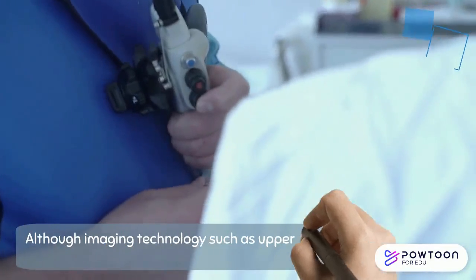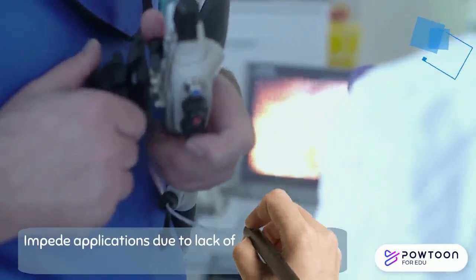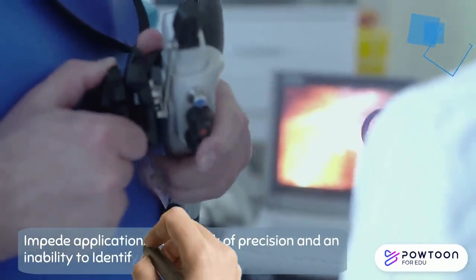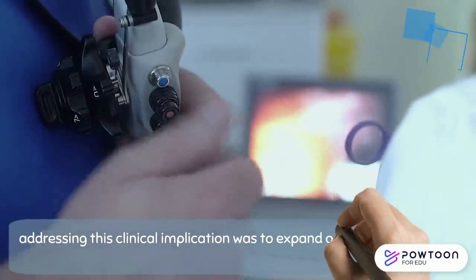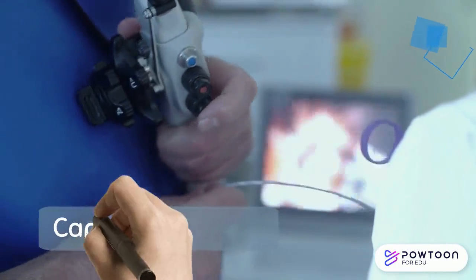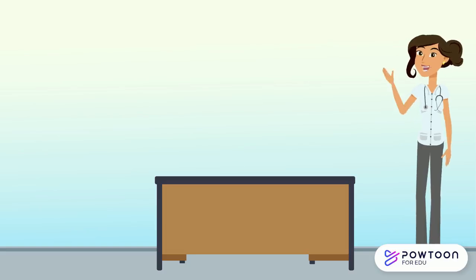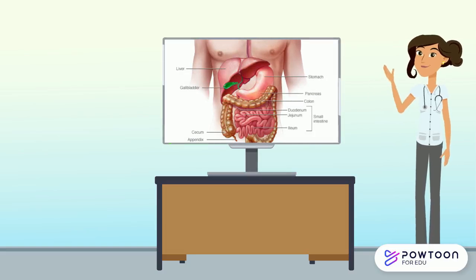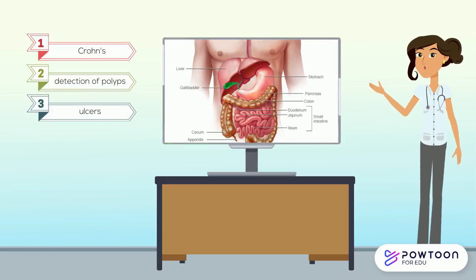Although imaging technologies such as upper gastrointestinal series exist, they impede applications due to lack of precision and an inability to identify subtle abnormalities. A means of addressing this clinical implication was to expand on the diagnostic capabilities of the small intestine with the introduction of capsule endoscopy. Capsule endoscopy is used to investigate the small intestine and has assisted in diagnosis of inflammatory bowel diseases such as Crohn's, and detection of polyps, ulcers, and tumours.